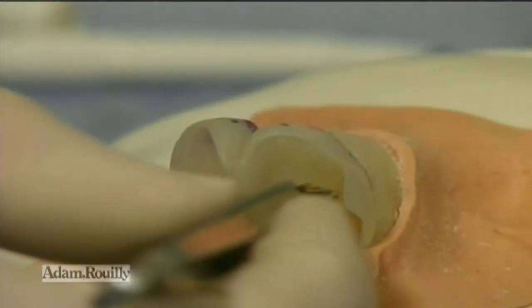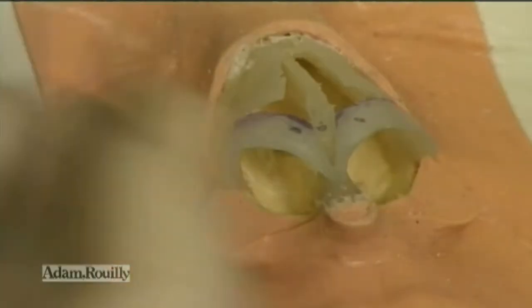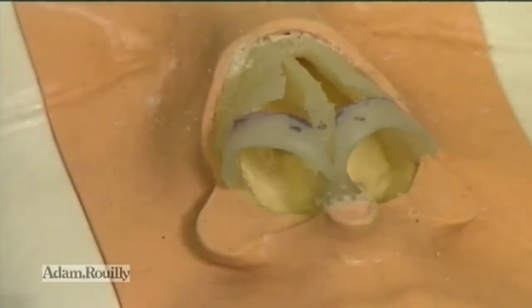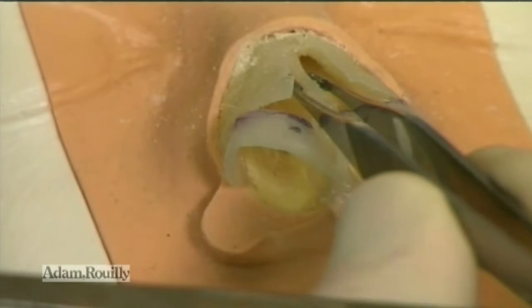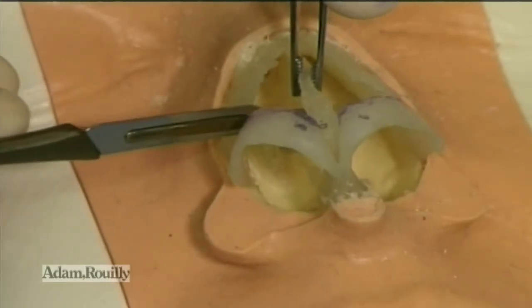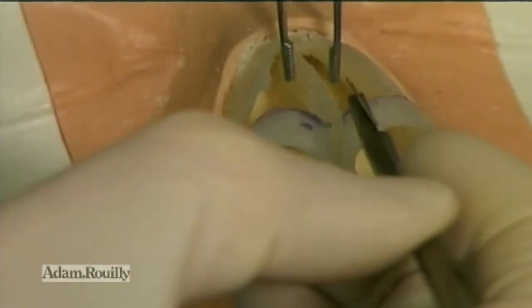We are now doing a septoplasty, preserving dorsal and caudal struts of 10mm. This is for graft material. The caudal septum is attached to the maxillary spine in the midline, so we just need to direct attention to straightening this septum to the dorsum. There is a deviation to the left, which we will need to straighten with some spreader grafts. To weaken it a bit further, we need to do 50% cuts inferiorly — 50% through the underside to the midpoints — just to weaken this dorsum so that we can buttress and straighten it with the spreader grafts.